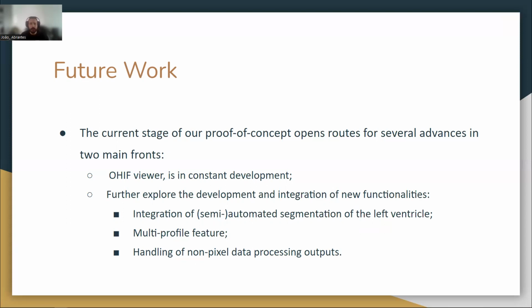And this team is further exploring the development and integration of new functionalities, such as the integration of a semi-automated segmentation of the left ventricle, and a profile feature, where the same system could have different instances for different use cases, only sharing the most common tools. Another feature in sight is the handling of non-pixel data for the processing outputs. Thank you so much.